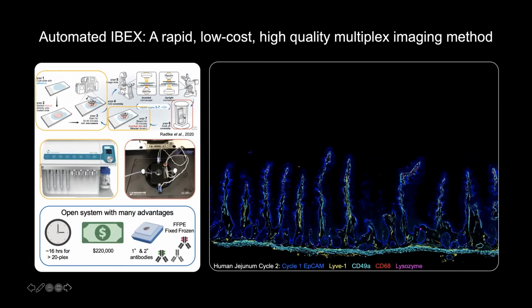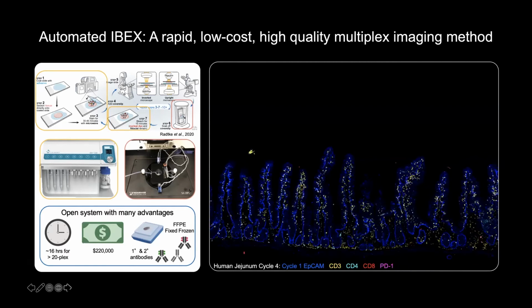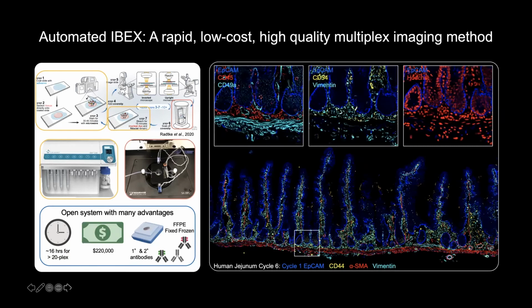And now I will cycle through the different parameters and you can just look at the quality. And so here's just the different markers. It's pretty boring. And then we'll zoom in so you can see, these are the tissue markers. We can push it up to even more than 6 cycles. And then when we zoom in, as a microscopist, I always want to look at the data, play with the raw data.